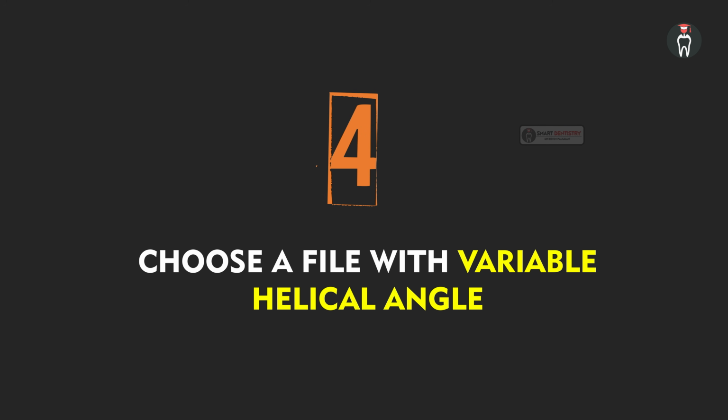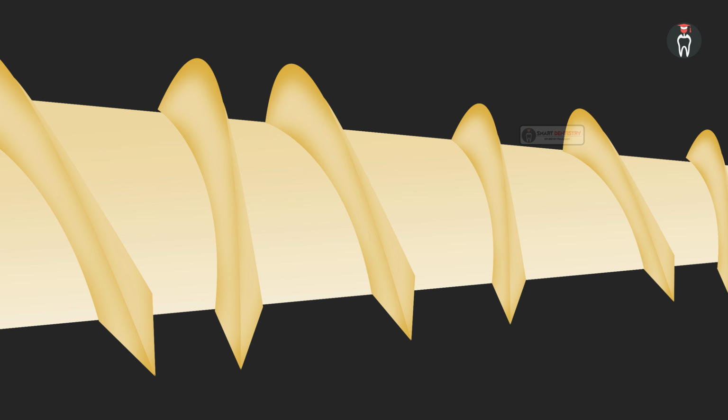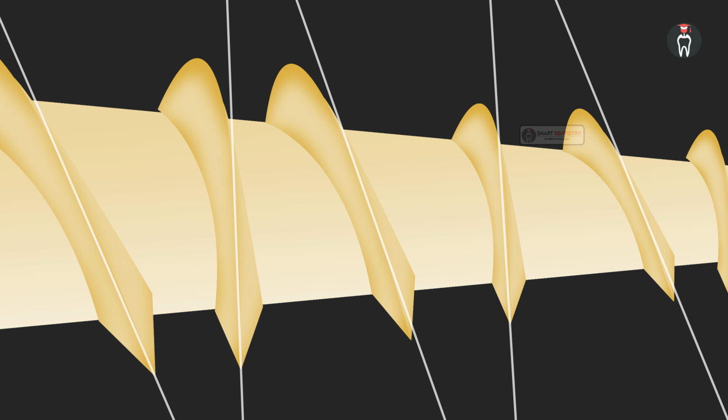The next feature that we have to take into consideration is called the variable helical angle. In this picture, you can see the cutting flutes or the cutting blades are not of the same angulation. Each flute is of a different angulation. Just imagine a screw getting threaded inside a wall because all the flutes are of the same angulation. Once the front or the smaller portions of the thread get inside the wall, the bigger ones simply follow the pathway which was created by the smaller ones.